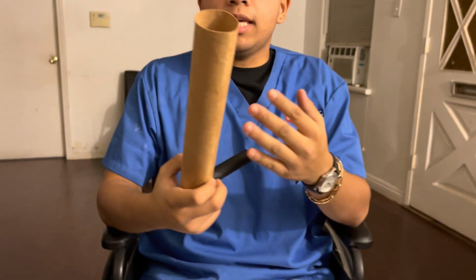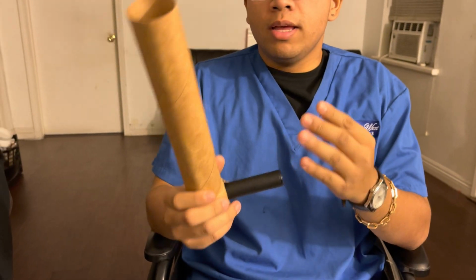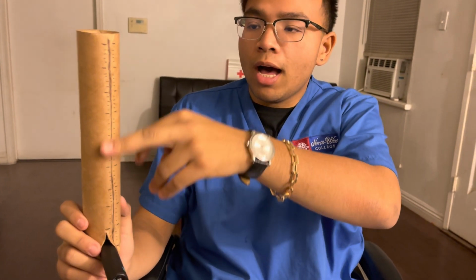Now, this is the peak flow meter test. It's basically a tube that is connected with the mouthpiece for the patient to inhale and exhale. And as you can see, the meter on the peak flow itself shows whether it can go either high or low, depending on how the patient exhales as he or she takes the initiative of inhalation.